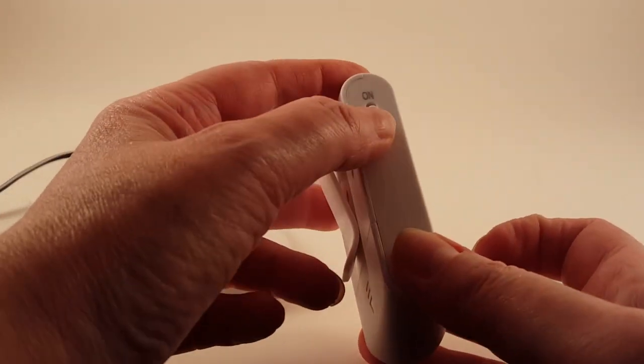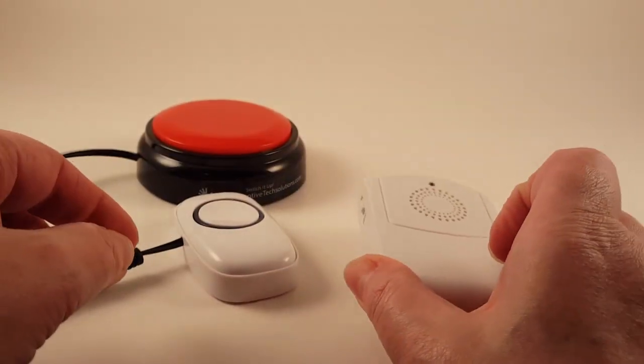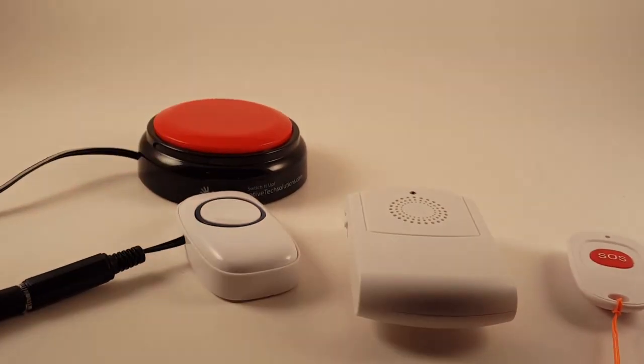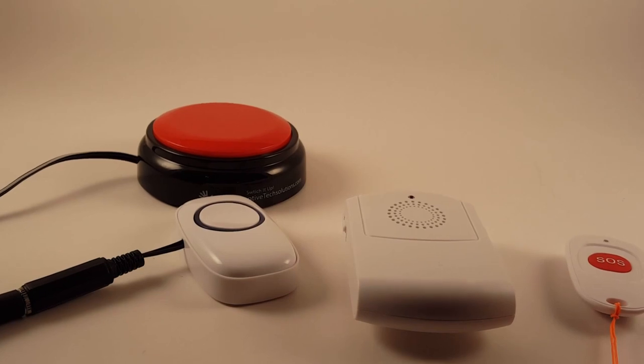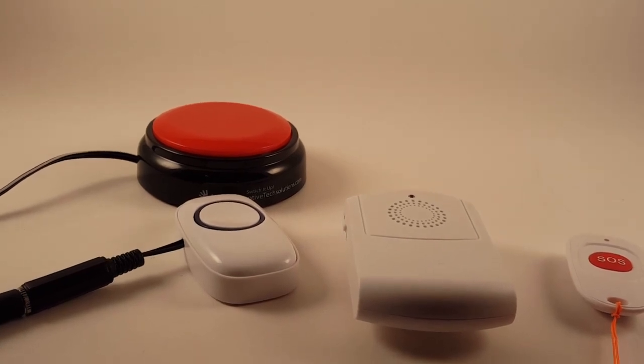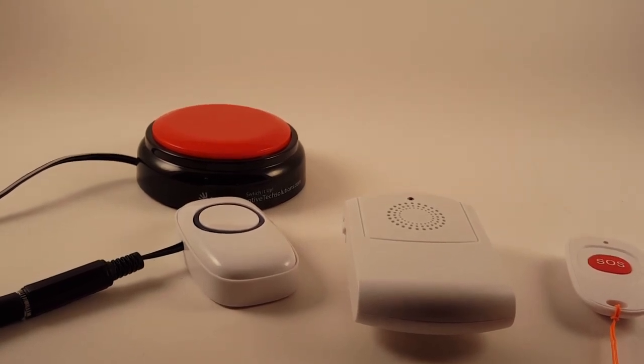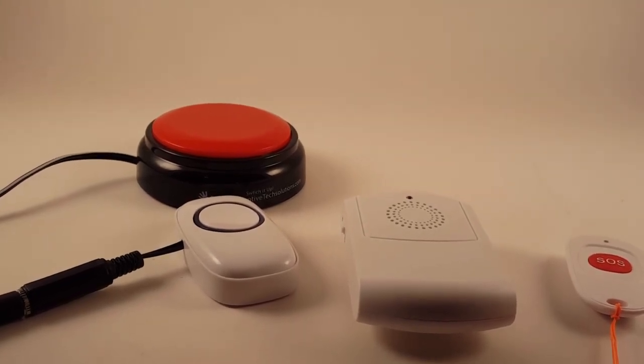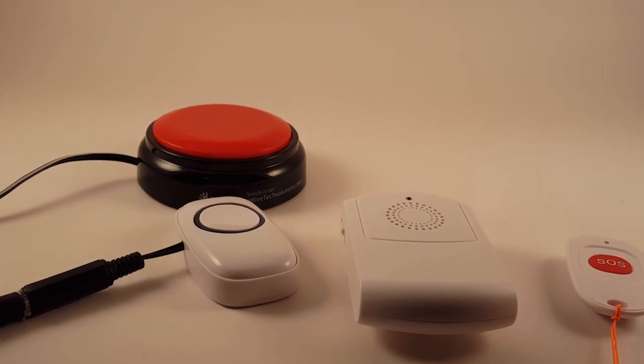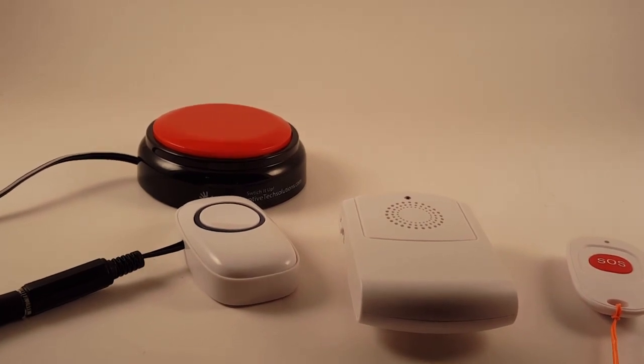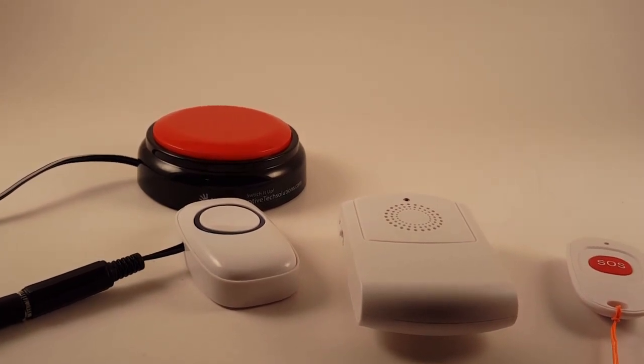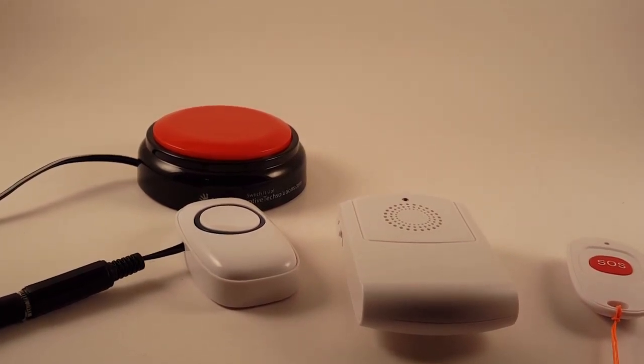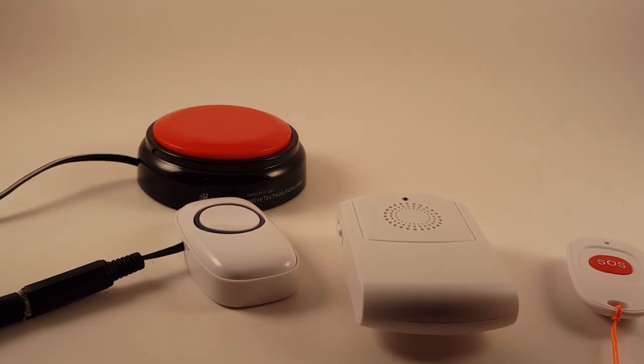On the side here, you've got your on and off for the chime. The chime does have vibration. It also has different volume levels. The lowest volume level is really very quiet, and then it goes up from there to a fairly loud volume.